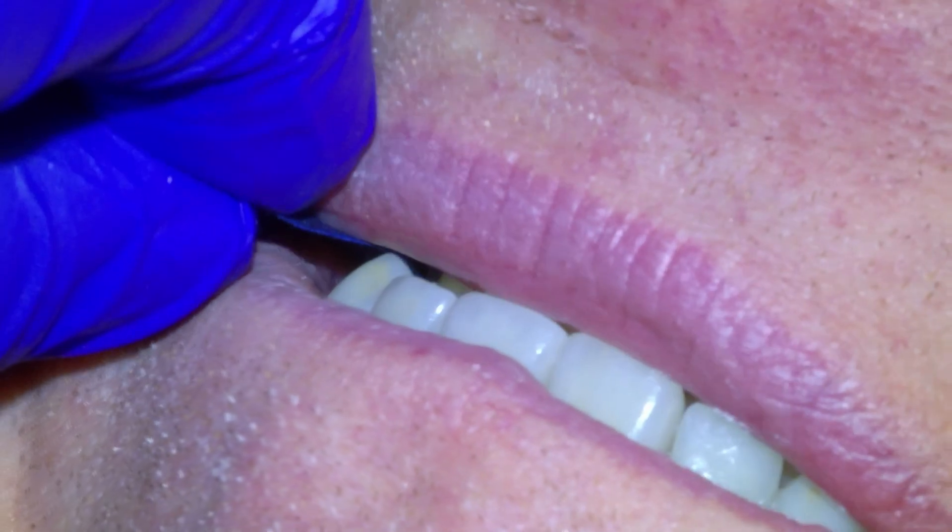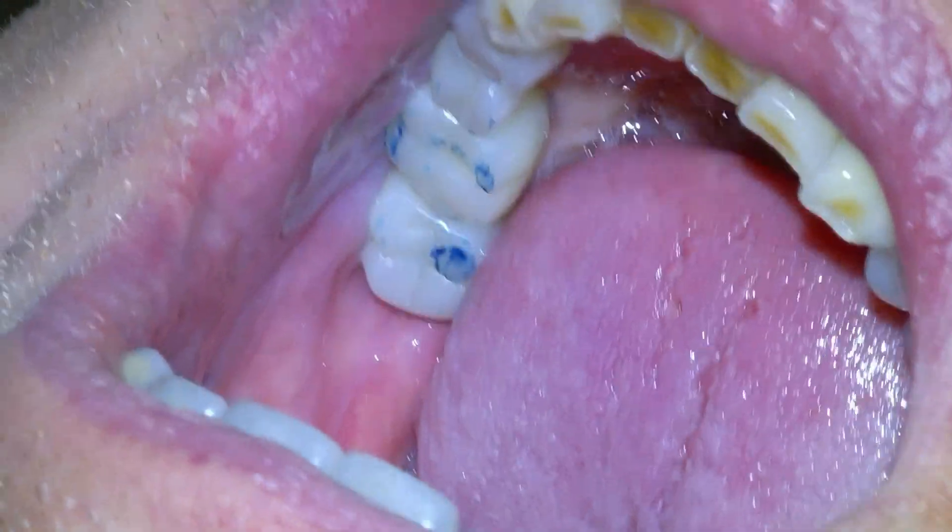Bite and grind, and open. How does the bite feel? There's definitely contact on it, but we can take it down if it feels intrusive. It feels just a little height. Yeah, let's take it down a hair. It's going to take some getting used to, but it should feel comfortable when you come together.